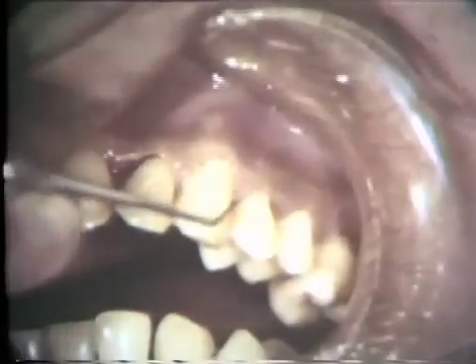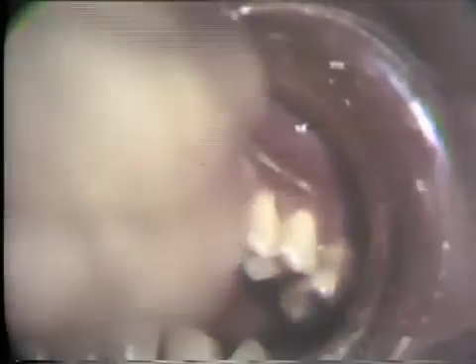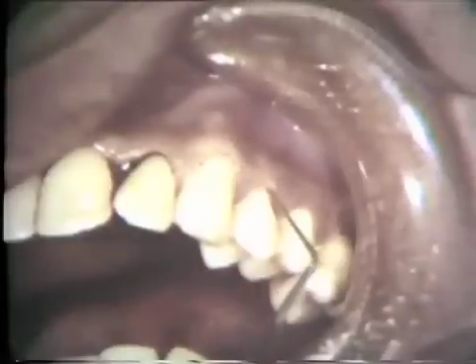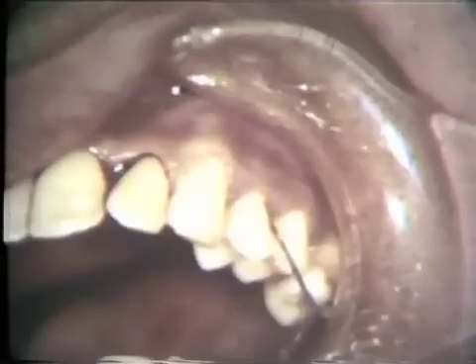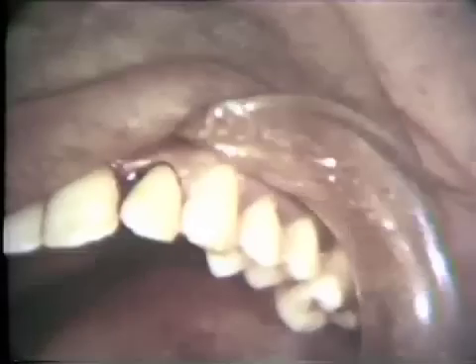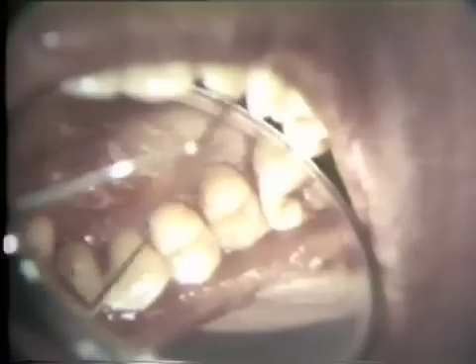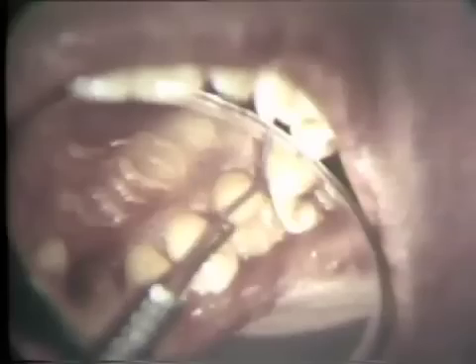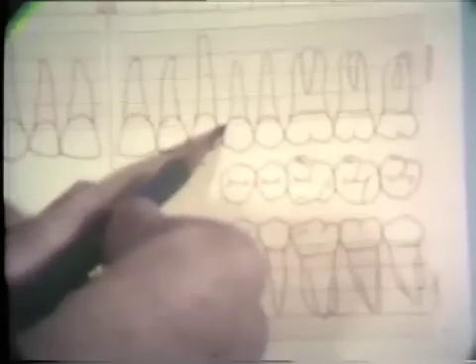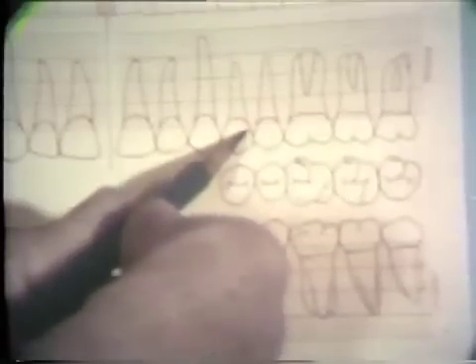Tooth number twelve is the index tooth for the left maxillary posterior segment. The probe is used on the mesiobuccal, buccal, and distobuccal aspects to measure the distances between the free gingival margin and the cemento-enamel junction. The cemento-enamel junction was not obscured by calculus. The mesiopalatal, palatal, and distopalatal measurements are obtained, and the mesiobuccal and distobuccal measurements are transferred to the chart.